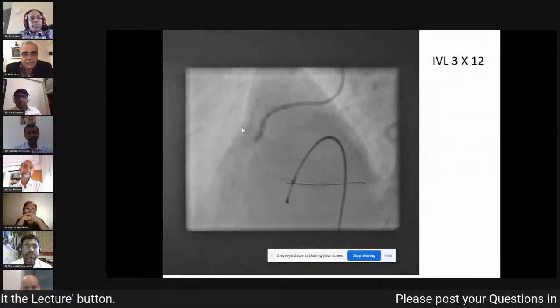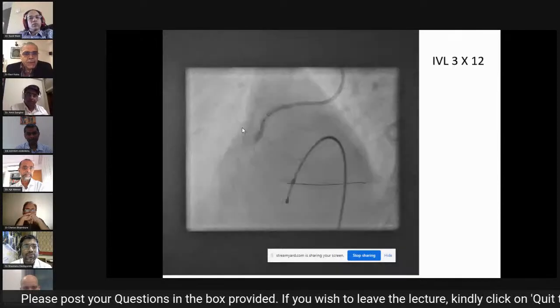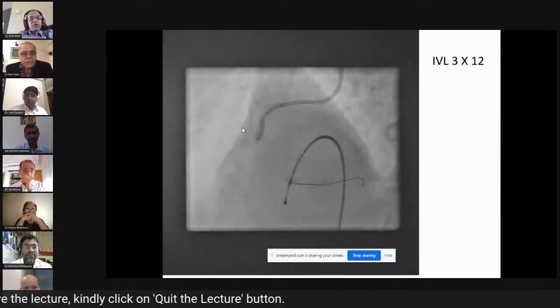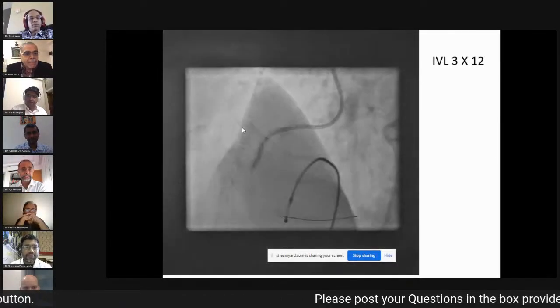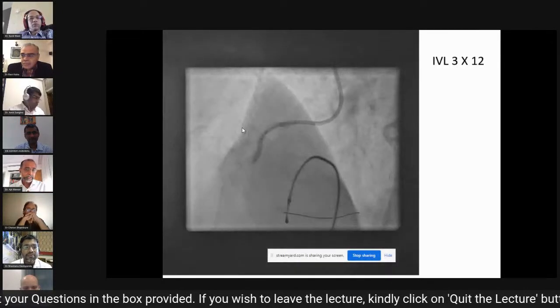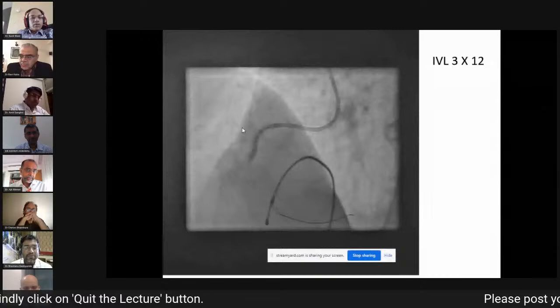And Dr. Menon, I wanted to ask you: is it absolutely forbidden to use a rota within stents? No, not at all. See, rota would have really helped in this case. Yeah, I feel. I was coming to that. See, when you see a lesion like this, and especially at a bend in the vessel, and you feel it is calcific, it's always better to go in with a rota up front.